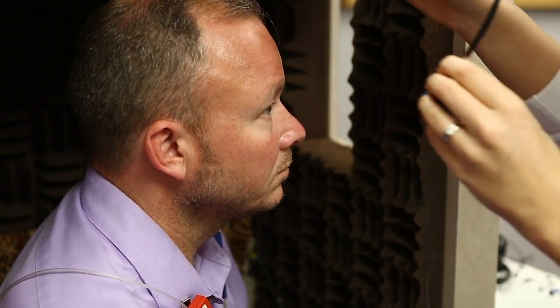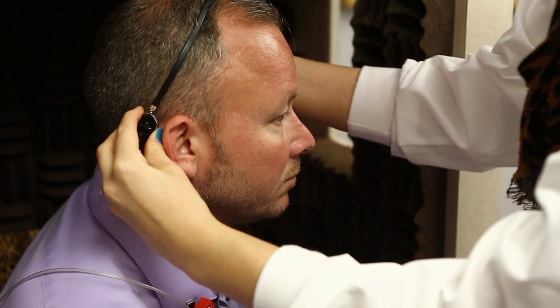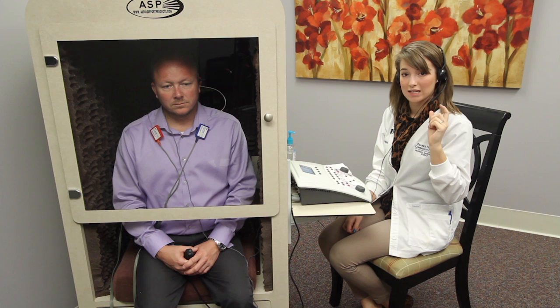The next test we're going to do is bone conduction testing. This test is much like air conduction, only it uses a bone oscillator placed on the mastoid to send tones directly into the cochlea, bypassing the external auditory canal. For bone conduction testing, you should really be doing masked testing, which is where you place a masking sound into the non-test ear while presenting tones to the test ear. This keeps the non-test ear, or the opposite cochlea, busy while you're testing the test ear.